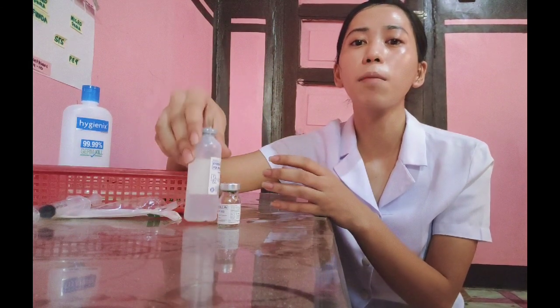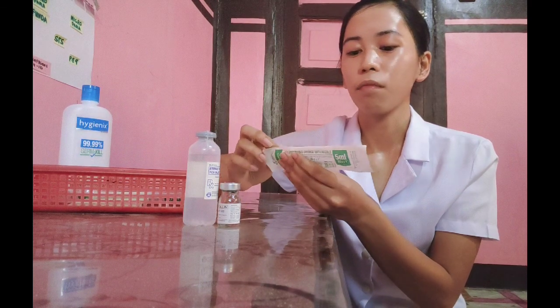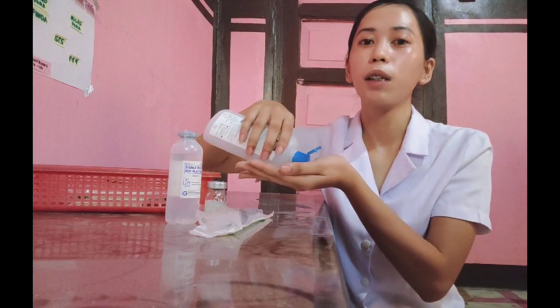Once the medication is reconstituted, store it in a refrigerator or as recommended by the manufacturer, and then discard the materials used in a proper receptacle, and then perform hand hygiene, and after that you will now document.